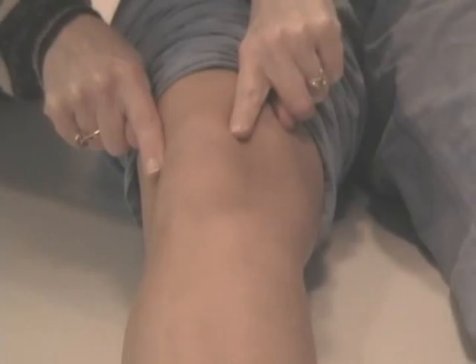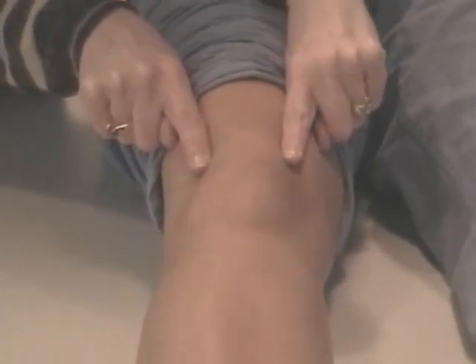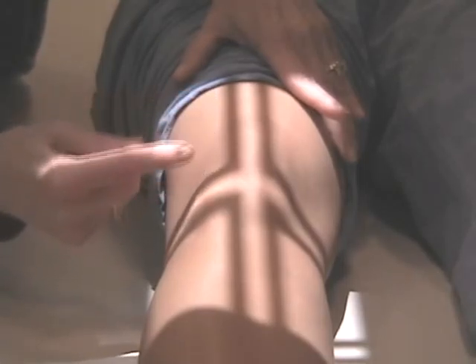See that? That would be to the lateral aspect. You don't want that. You want the patella not midline, but slightly medial. That will actually place the condyles parallel to the surface of the table here. Okay? We have the crosshair coming down the center of the leg. The leg is turned in just a little bit to have the patella slightly medial. And then this crosshair here enters the leg 1/2 inch below the apex of the patella.